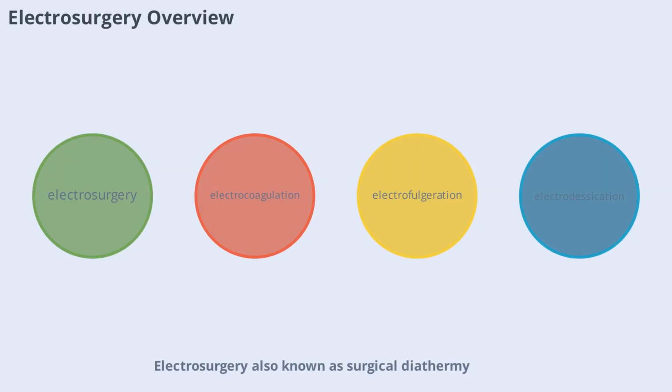Electrosurgery, also known as surgical diathermy, uses high-frequency currents ranging from 1.5 to 7.5 million cycles per second. 3 classes of electrodes are used: single-wire electrodes for incising and excising, loop electrodes for planing tissues, and heavy bulkier electrodes for coagulation.